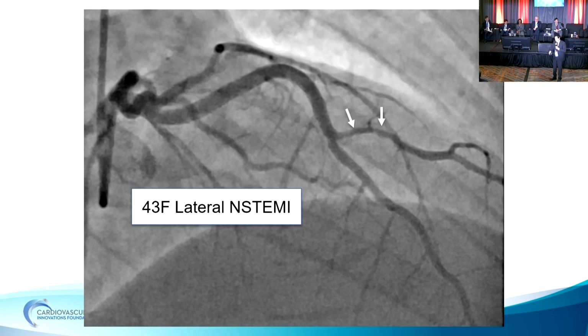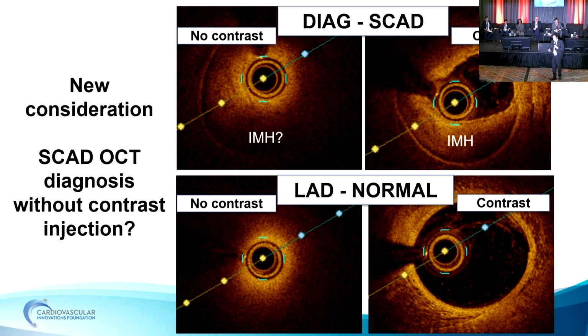The question now, as a side note, is whether you need to do contrast at all with OCT. This is a lateral non-STEMI and a diagonal indeterminate lesion. And I'll just throw this out there as a consideration. So the top panel is the diagonal.